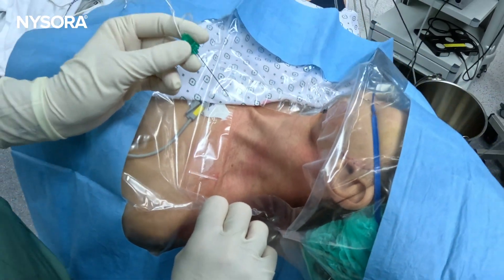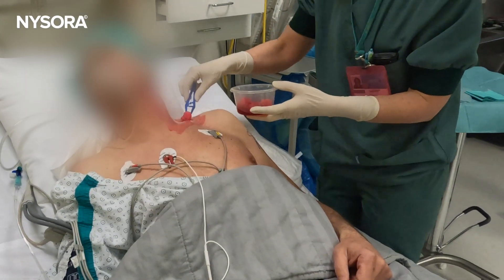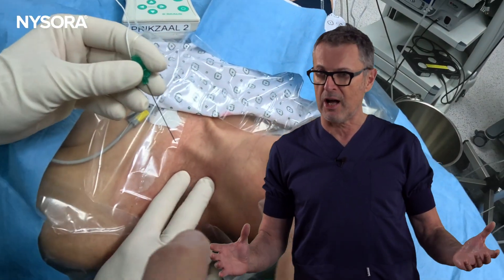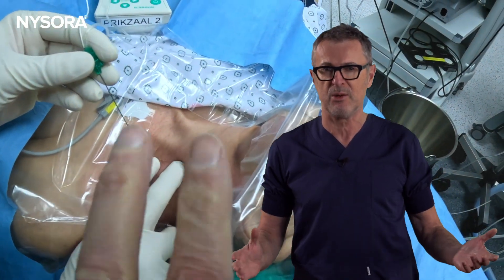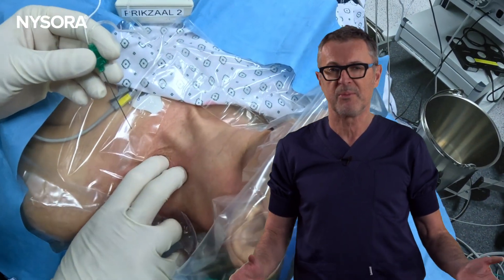For the first case of the day, we had a patient scheduled for shoulder surgery. We prepped the patient for a single shot interscalene nerve block. Time was of the essence, but all of our ultrasound machines were already in use, so we had to do something different to prevent delay in our operating room. We opted for a nerve stimulator guided interscalene brachial plexus block.